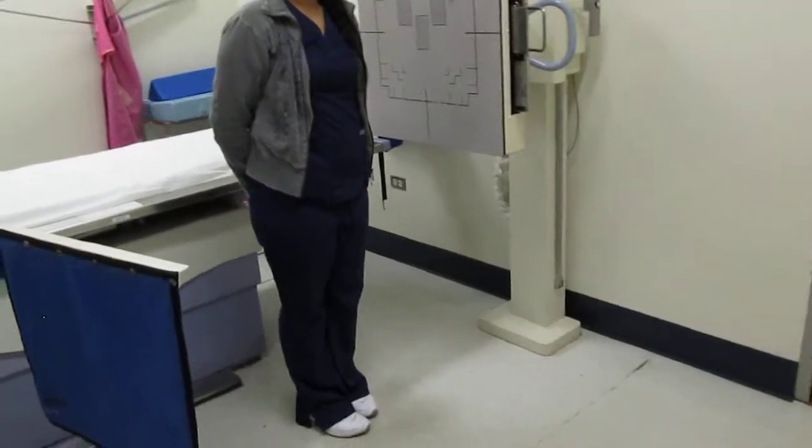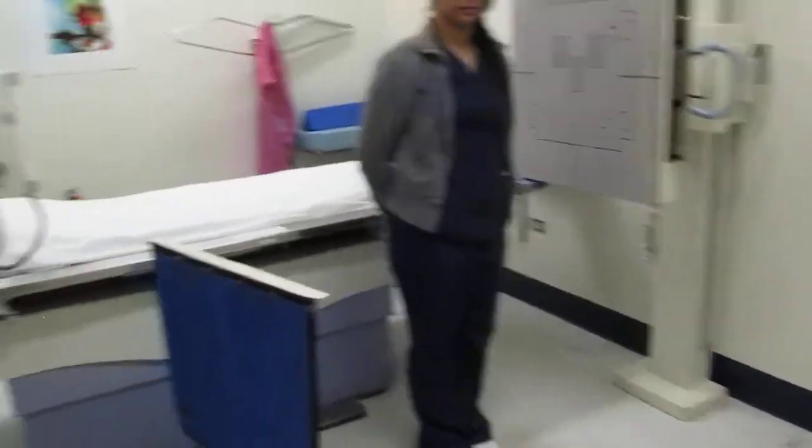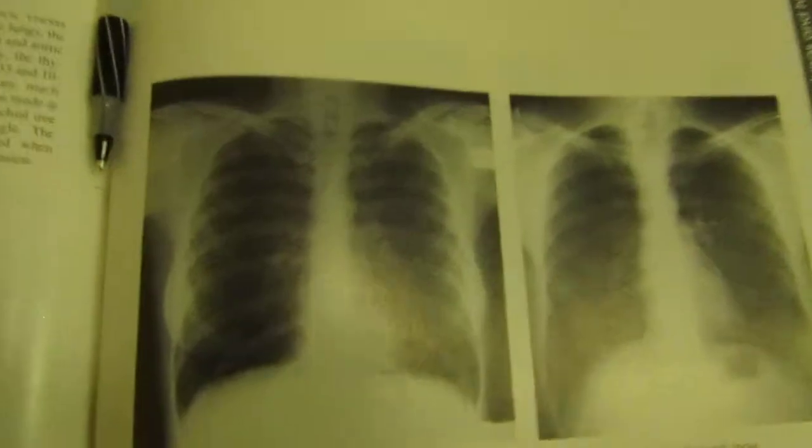Okay, I'm gonna grab the cassette out. Bring this back to the reader. Jane, just relax a few minutes. I'm just gonna double check those x-rays and we should be good to go. So I'm gonna put this into the reader and it reads it. So this is my reader since I don't have the computer. This is the first x-ray I took.